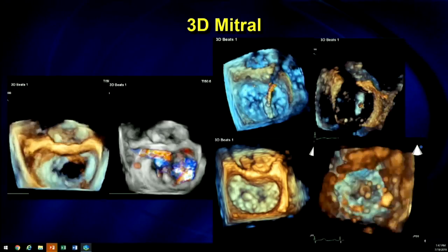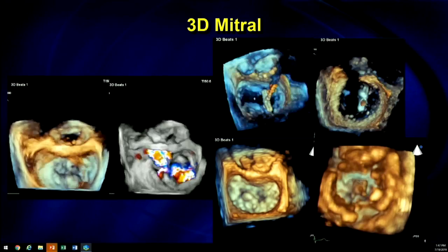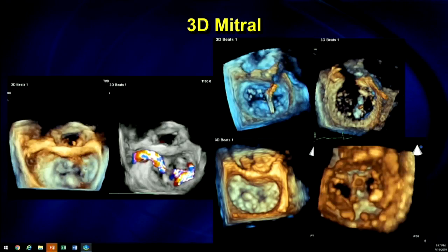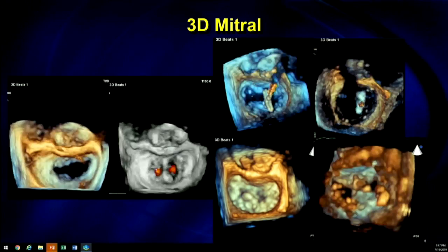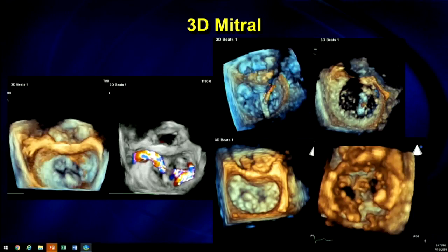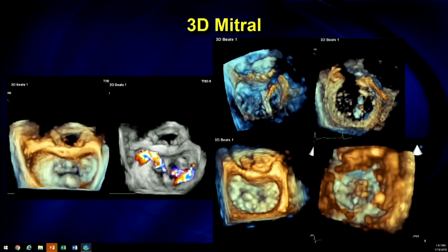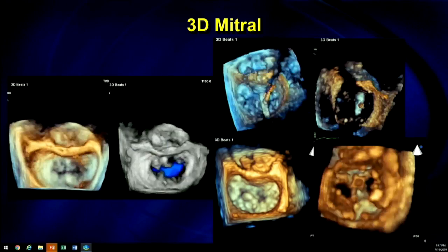With MitraClip, 3D's really changed everything. You get a nice assessment of anatomy, what's going on. Here we see there's an A2 and a P2 flail, and you have scissor-like jets coming across, and you can see that very quickly. Clip arm alignment and assessing for rotation. When you go into the ventricle, very easy with 3D. You get nice views of leaflet insertion as well.